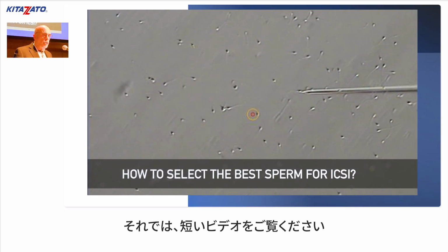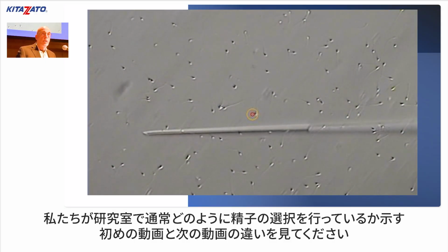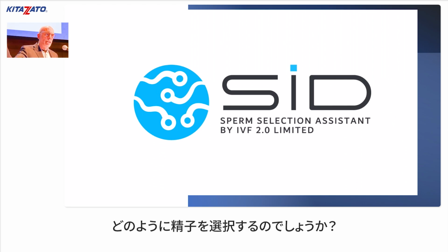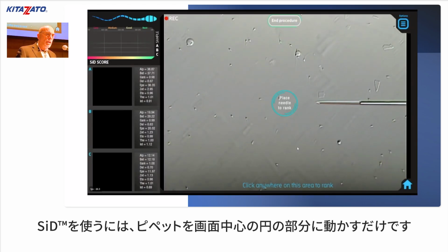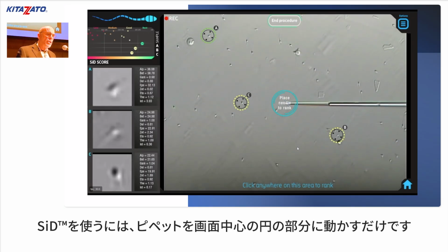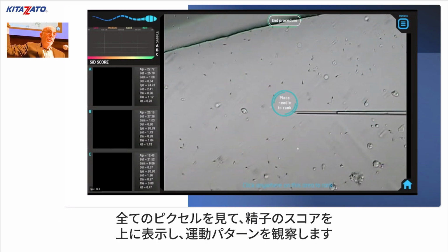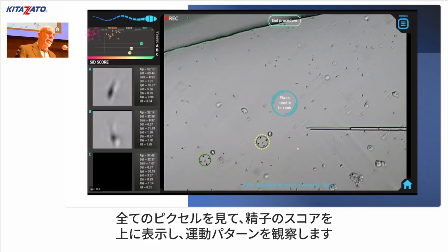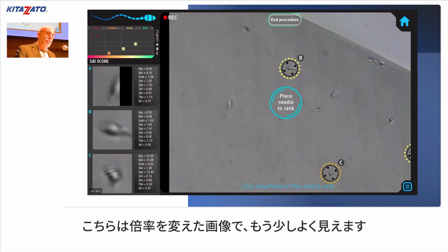So here you see a short video of how we normally in the lab do sperm selection. There are variations on what you just saw, but how are you going to select the sperm at that level? So when you do SiD and you move the micro tool where you're going to put the sperm into the middle, this is the interface. It activates SiD, and it will look at all the pixels and score all the spermatozoa that are there and look at their motility patterns. So here's a different magnification where you see things a little better.